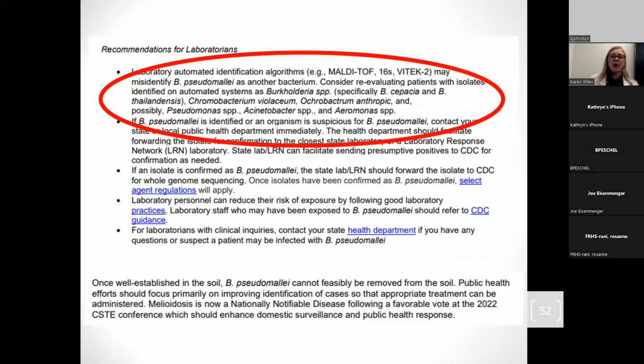Obviously, if you have a mucoid Pseudomonas and it's pigmented, no, you don't have to identify it. But if it's a nice clear one, you might want to consider doing the rule out. Same way with the Acinetobacters and Aeromonas. So we're recommending that you put big signs up on your MALDI. What was your growth rate? As a reminder, that you have growth at 48 hours. Don't put it on the MALDI.